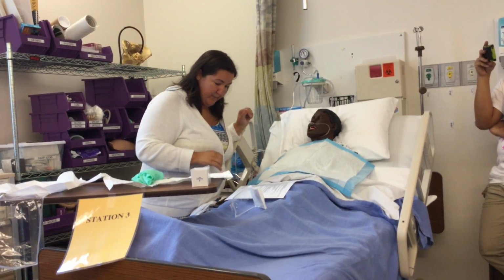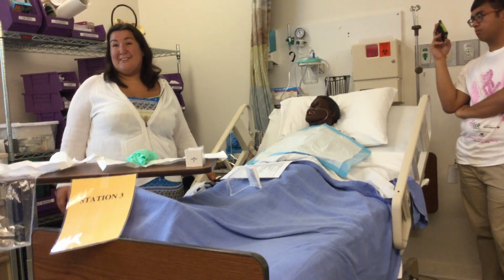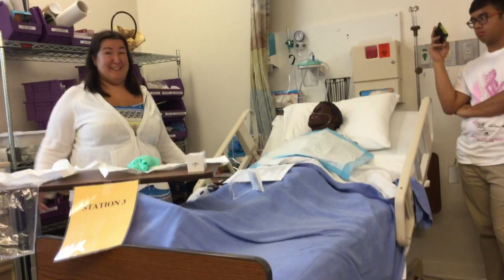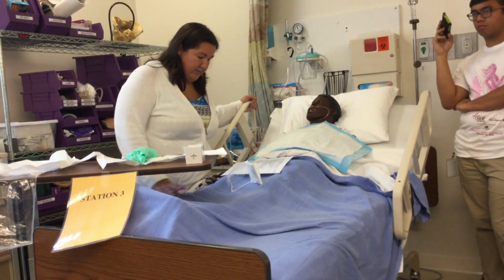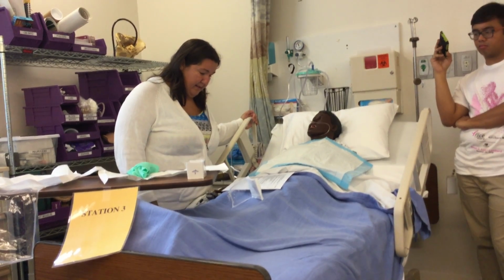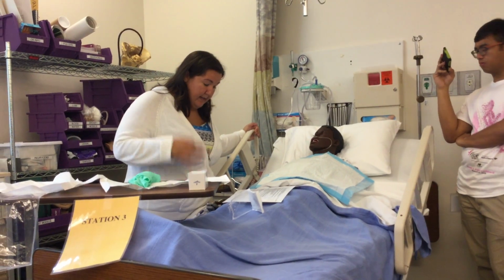And you reassess your patient, they're doing better. You want to ask them if the bed is comfortable. If it's too high for them, you can bring it down a little. But I don't want to bring them flat because they're obviously having respiratory problems, so you don't want to lay this kind of patient all the way flat. They can breathe better if they're sitting up a little bit. You want to look at their saturation, what they're breathing at. You want to make sure you throw away all your stuff and that you document that.